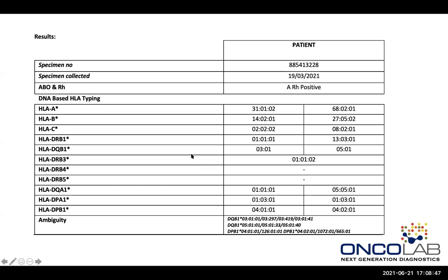As you can see with this HLA-DQB1, that wasn't possible. And so at the bottom of this report, we list those ambiguities. It is safe to accept that if you are testing a sibling or a related donor, you will get the same number of ambiguities, and it won't be necessary, if you choose that donor, to specifically go and resolve them.